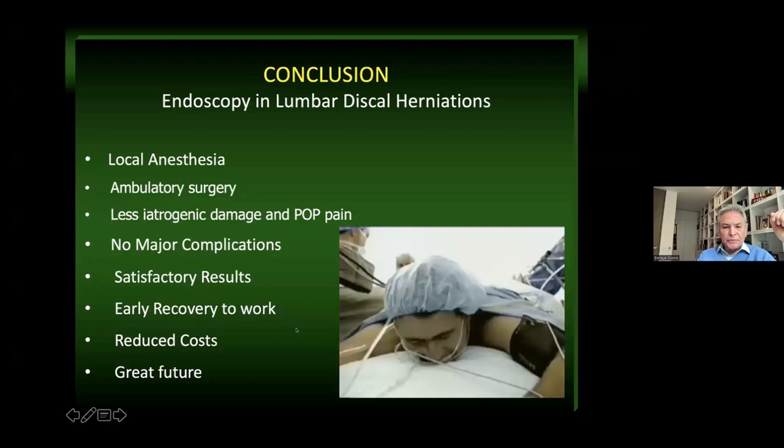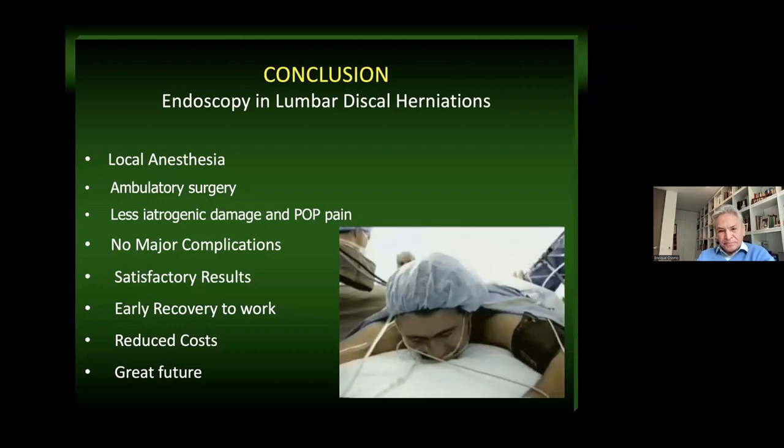And in conclusion, this endoscopic approach in lumbar disc herniation is a procedure under local anesthesia, is an ambulatory surgery, has less iatrogenic damage, less postoperative pain, no major complication, satisfactory results, early recovery to work, reduced cost, and I think has a great future. Thank you very much.